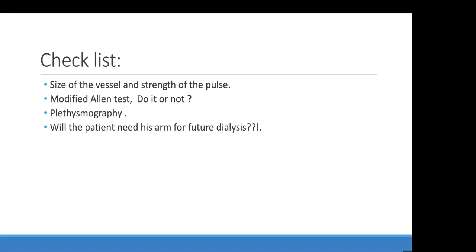The Allen test and its modified variant: should you do it or not? Personally, I don't do it because I don't believe it will change my decision to go radial or not. However, train yourself to do it. I'm sure you're going to be asked about it. It's knowledge that you have to know. I'm going to explain it in the next few slides. And I did Allen testing on myself and I actually failed it. I have an abnormal Allen test. I don't have good collaterals.